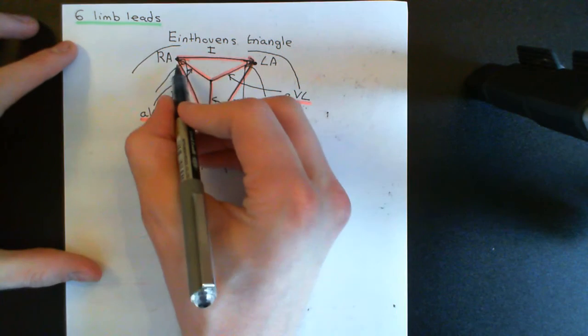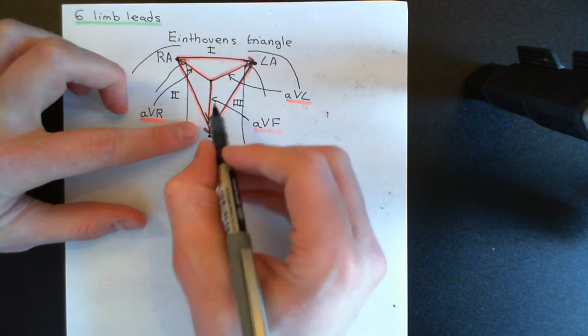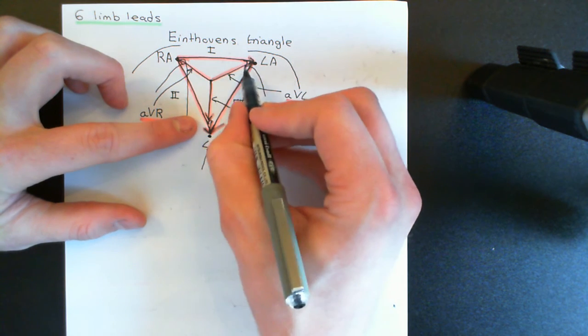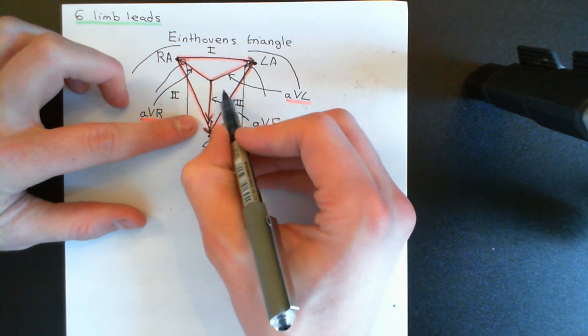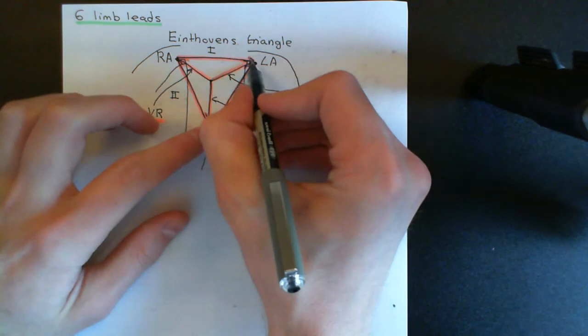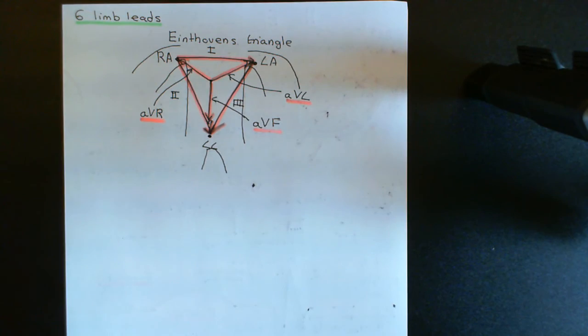Now, we have already drawn the classical one, which is lead 2 from the right arm to the left leg. I hope that you could start to imagine what some of these other ones would look like. They'd be more complicated because you're looking at a linear angle, basically. Okay, so for instance, if we look at lead 3 here, now it's not in line with the direction perfectly that the cardiac vectors are going, but still think it through. Think of how the currents are moving and what effect that's going to have on the electrical potential of these 2 points, and you will be able to work out what the ECG pattern would look like. You'd at least be able to have a very good go at working out what the ECG pattern is going to look like.